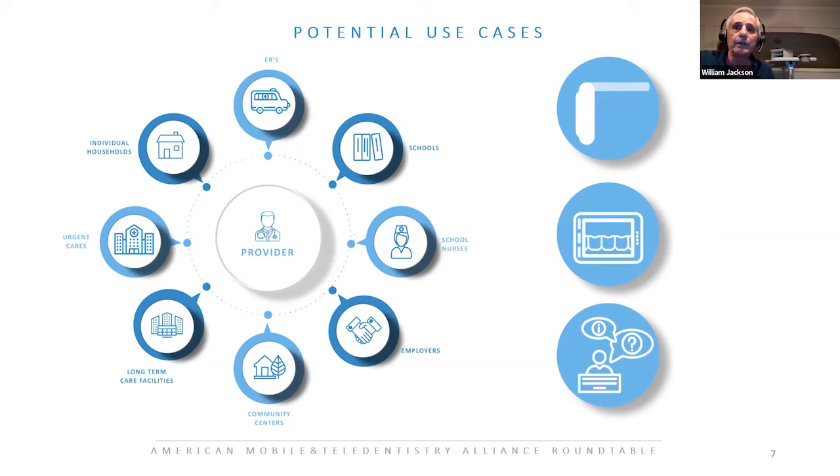But basically with that, I'm going to turn it over to Dr. Simpson and let him talk about some of his visions of how people are using it too.